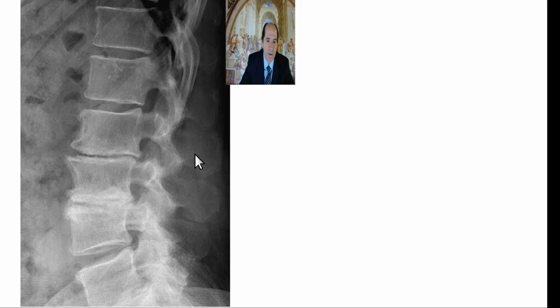And now here's a patient again with severe degenerative disc disease of the spine. You can see there's severe disc space narrowing, virtually complete, with some early evidence of interbody fusion, bridging osteophytes. You're headed on that path towards DISH, diffuse idiopathic skeletal hyperostosis, with bridging osteophytes. They're going to bridge together and fuse, suggesting you've got abnormal motion at this disc space level, such that the vertebra wants to stabilize that abnormal motion by fusing the bones.